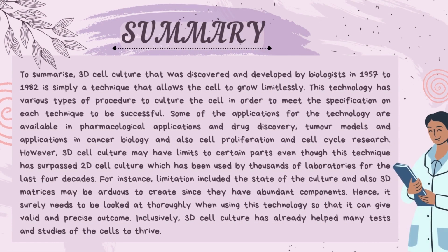Lastly, to summarize, 3D cell culture that was discovered and developed by biologists in 1957 to 1982 is simply a technique that allows the cell to grow limitlessly. This technology has various types of procedure to culture the cell in order to meet the specification on each technique to be successful. Some of the applications for the technology are available in pharmacological applications and drug discovery, tumor models, and application in cancer biology and also cell proliferation and cell cycle research.